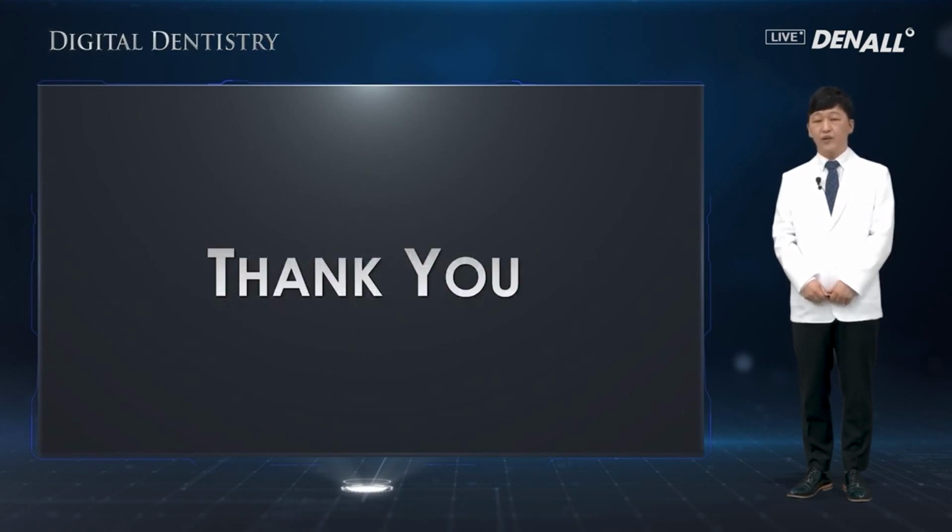So this is all I have prepared. If you are afraid of using a 3D printer, I hope this helps you to overcome that fear. In 2 weeks' time, I'm going to talk about the 3Shape dental system to design prostheses. Thank you for your attention.